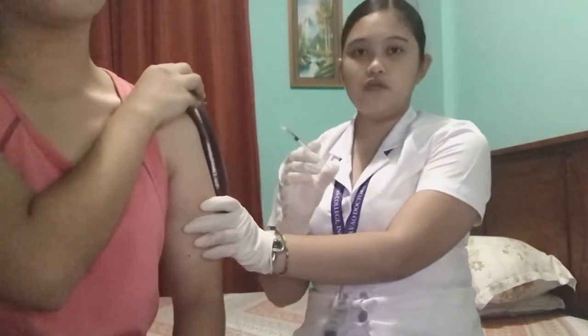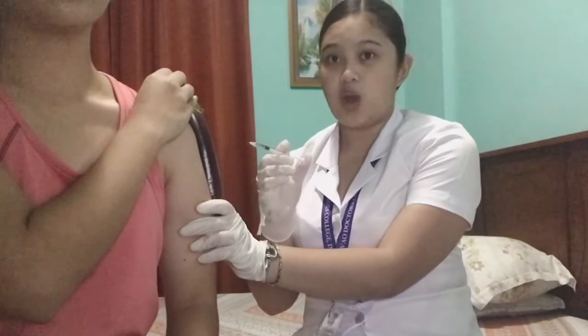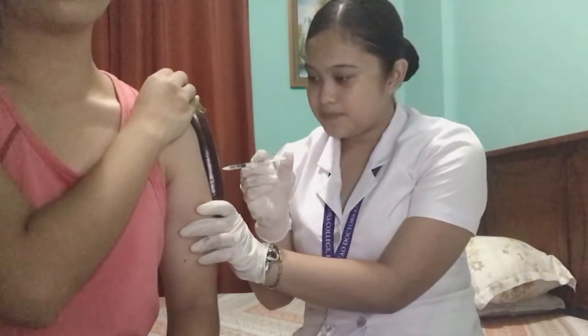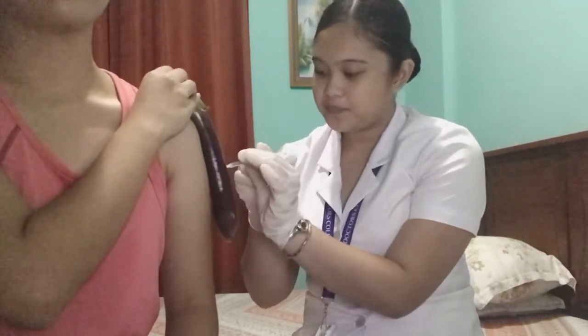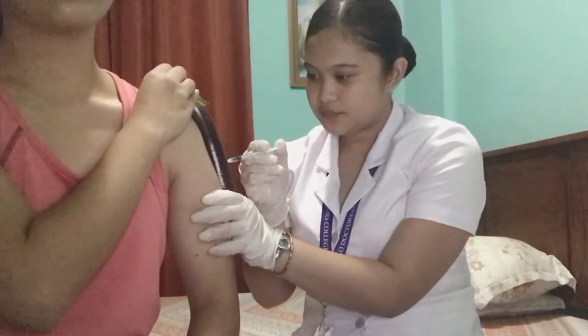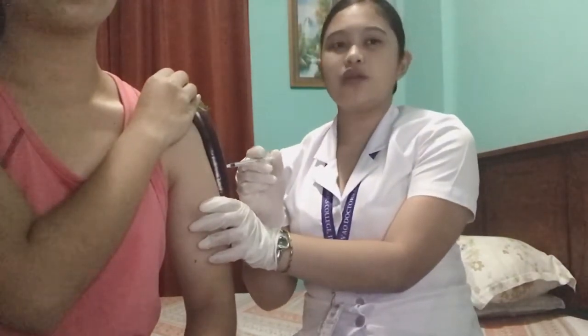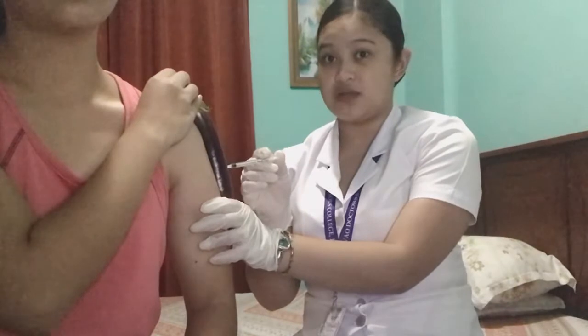Okay. So, move your dominant hand to the end of the plunger and then slowly inject the medication over several seconds. Then hold the syringe to keep it still for a while.